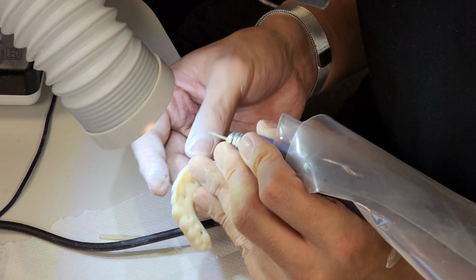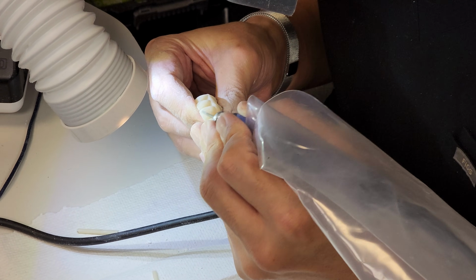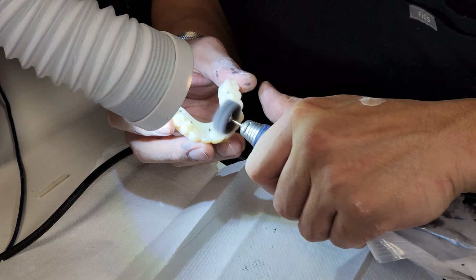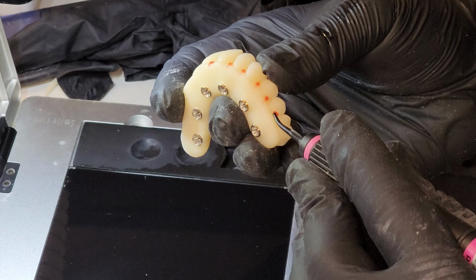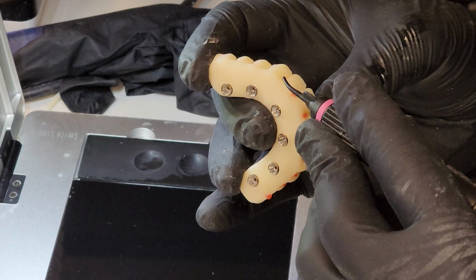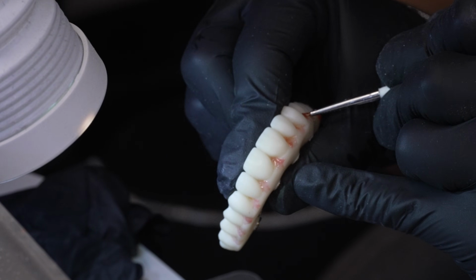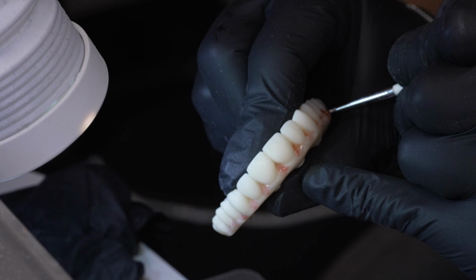Next, the technician smooths off all the little bumps and irregularities on the provisional hybrid bridge, and he cuts off the supporting bars as well. And then at this point, we start the process of refining the dentures. We define all the lines in the dentures more and add small depressions and more natural looking features into the teeth so they don't look computer made, but something more natural that the patient can be confident with.